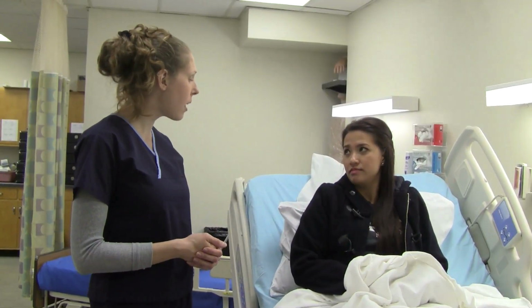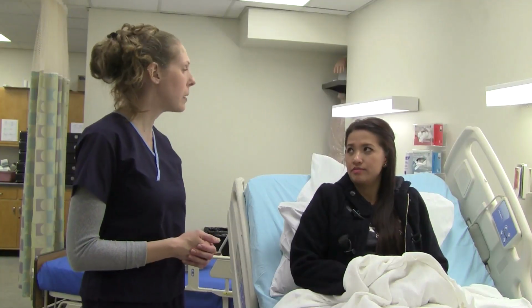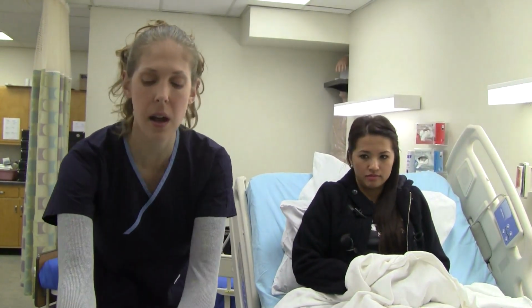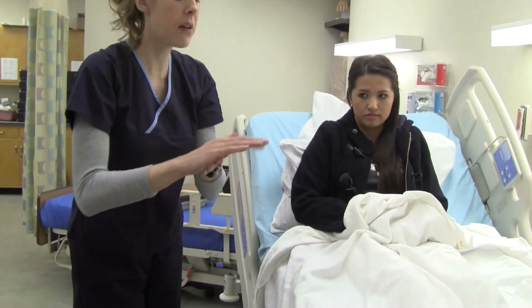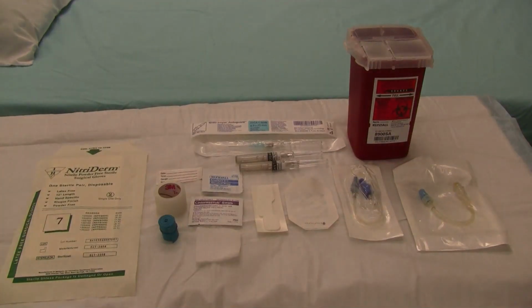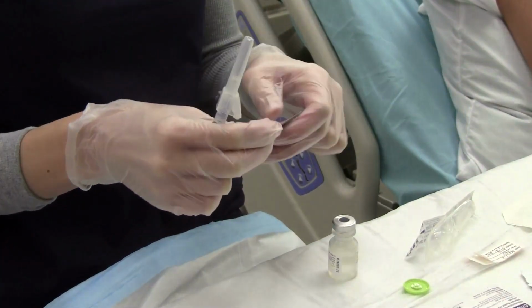Yeah, so it gives us a route to give you medications, okay? Have you had any allergies, any bad reactions, anything like that? No. Okay, all right, good. I'm just going to wash my hands and then we'll get started. Gather all of the appropriate equipment. Perform hand hygiene and observe other appropriate infection control procedures.